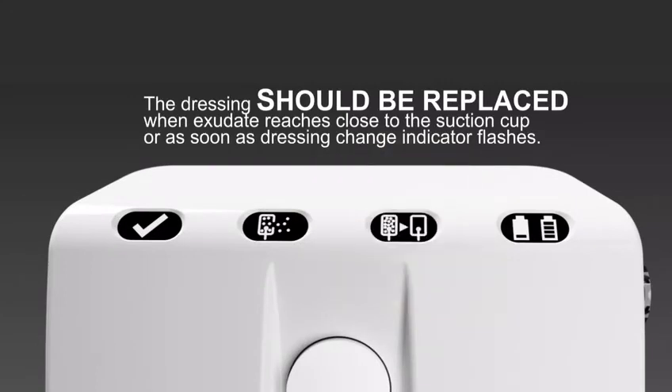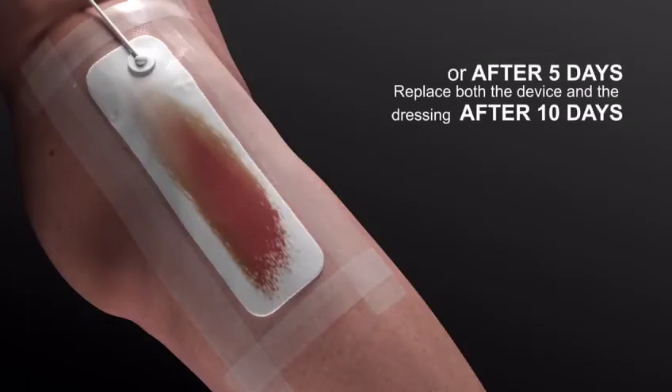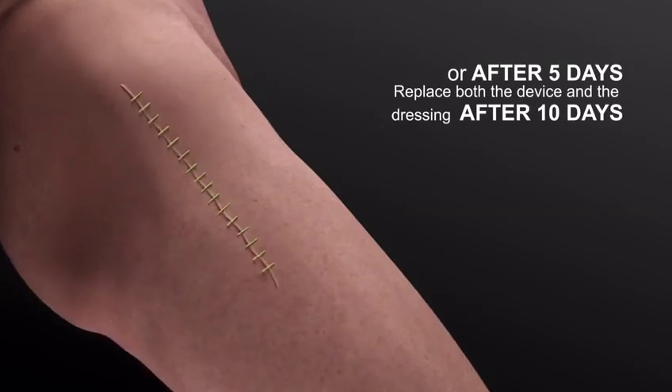The dressing should be replaced when exudate appears close to the suction cup, or as soon as a dressing change indicator flashes, or after five days. Replace both the device and the dressing after 10 days.